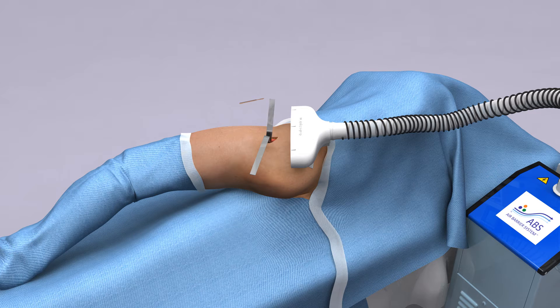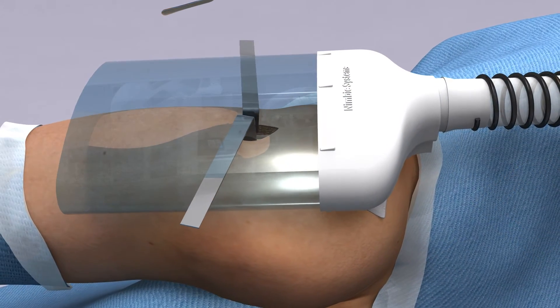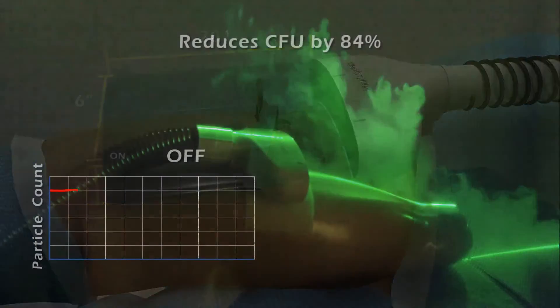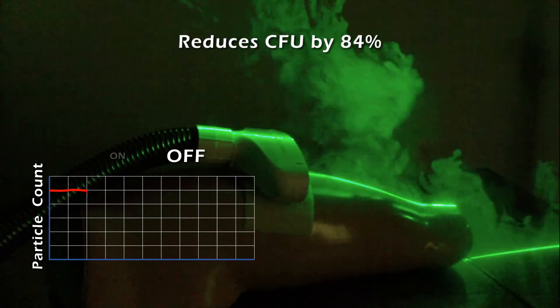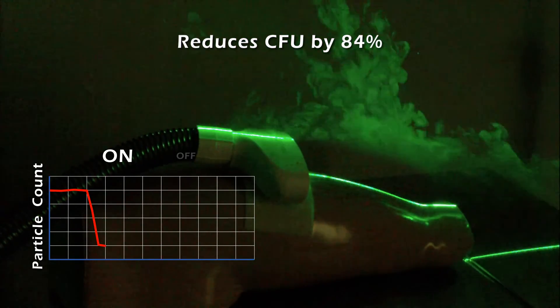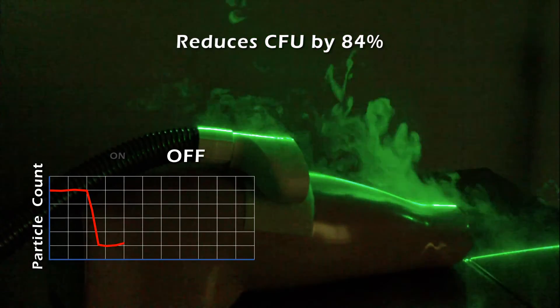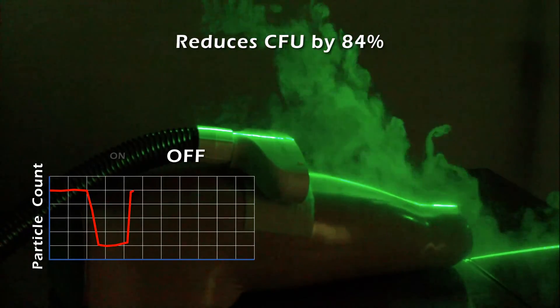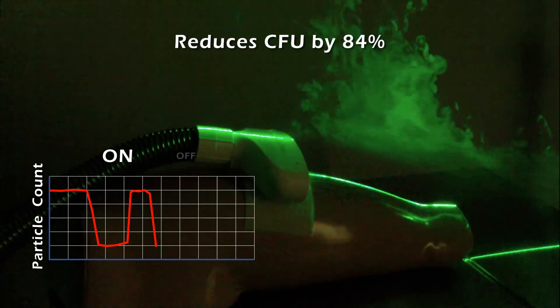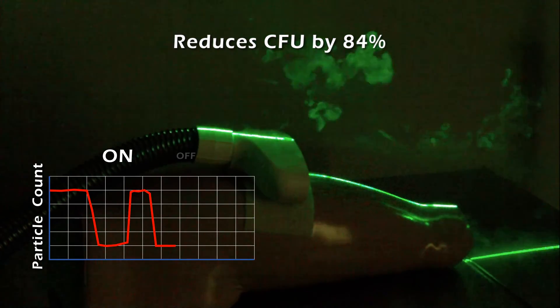A clean air cocoon produced by the ABS creates a protective environment of 6 by 20 inches with a 2-inch depth. Particle counter analysis shows that a surgical incision environment may contain many thousands of bacteria-carrying particles per cubic meter. As the ABS airflow is turned on, the system creates a barrier of air that reduces the particle count and presence of microorganisms by over 84%.